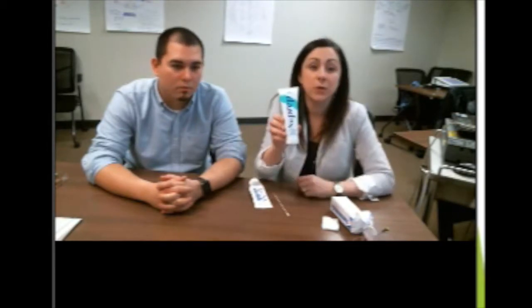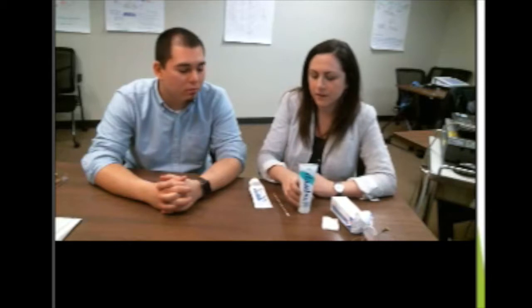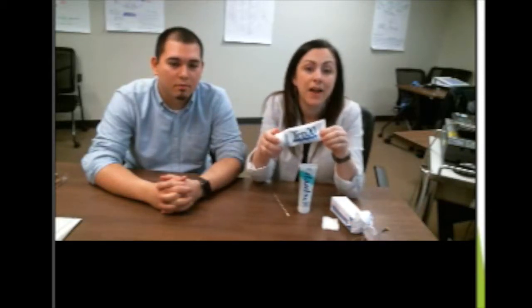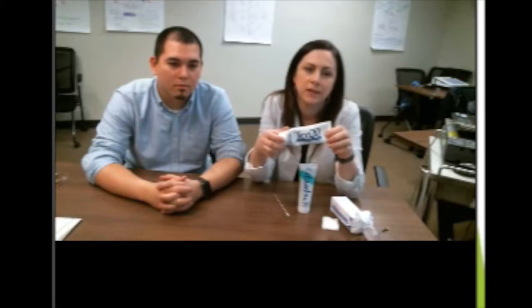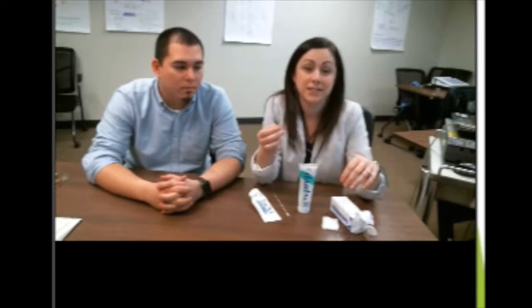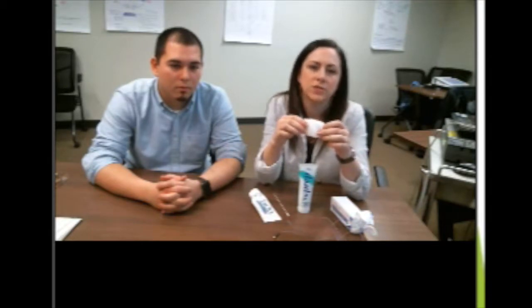So first, let's take a look at the supplies we need. Here, we have a long Q-tip. We have some exfoliant gel, and this will be used to prep the skin. We have some conductant paste, which will be used to apply the electrode to the scalp and encourage conduction of ions from the scalp to the electrode. And then we, of course, have our gold cup electrode itself, and some small pieces of gauze or any kind of tissue paper or towel will do as well.